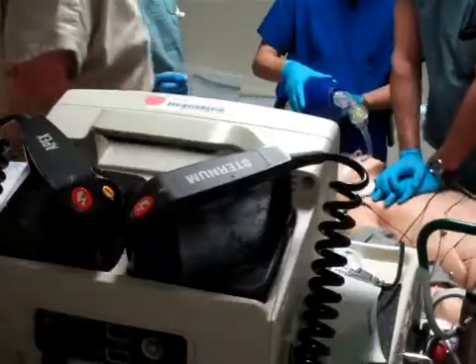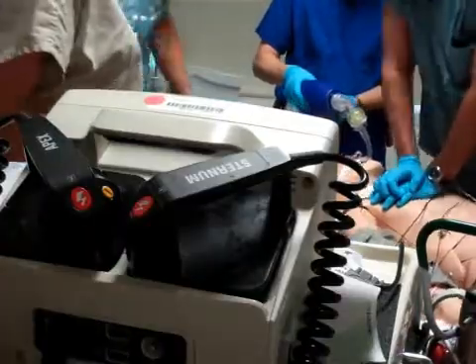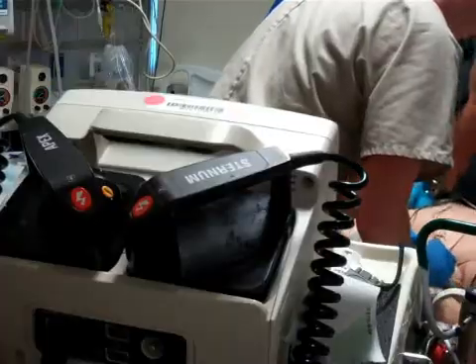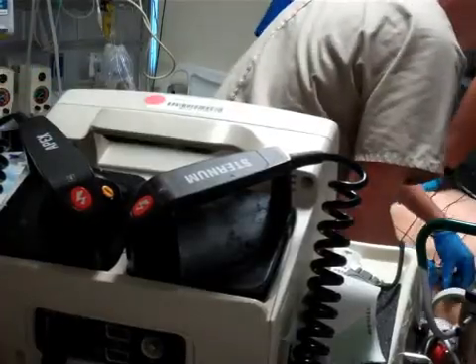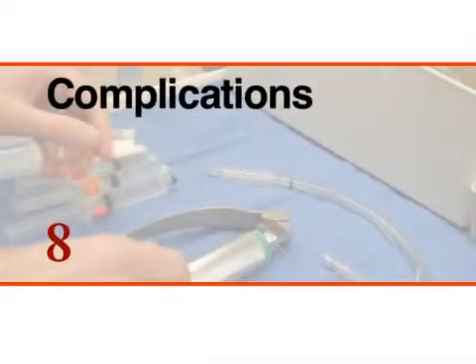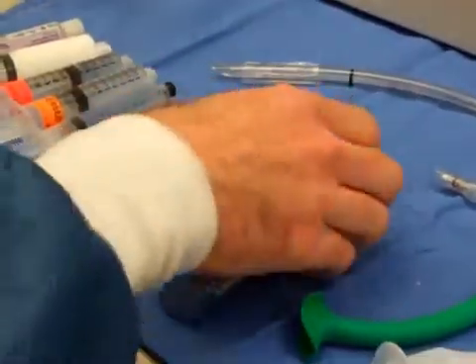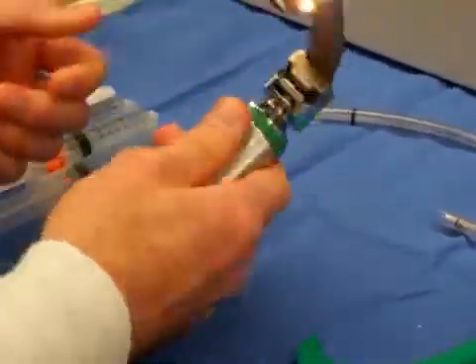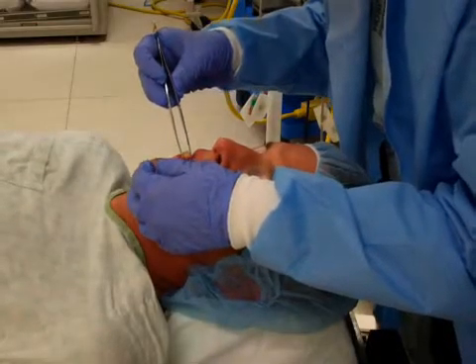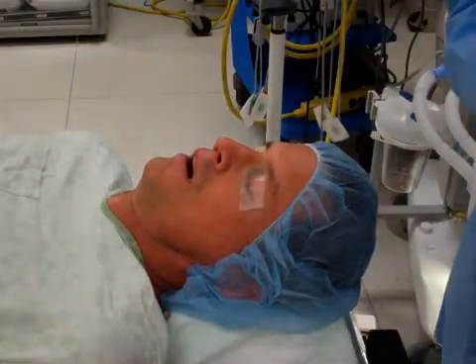The laryngeal mask airway may be left in place for the duration of the resuscitation. If a definitive airway is still needed, an experienced provider in airway management should replace the LMA with an endotracheal tube. Complications associated with LMA use are similar to those with other airway management tools; however, there may be fewer complications than with bag and mask ventilation and endotracheal intubation.